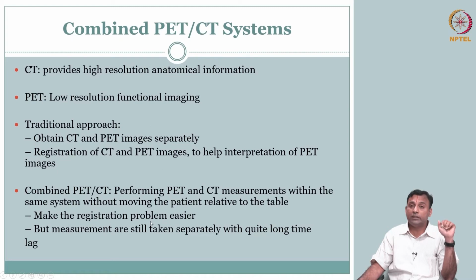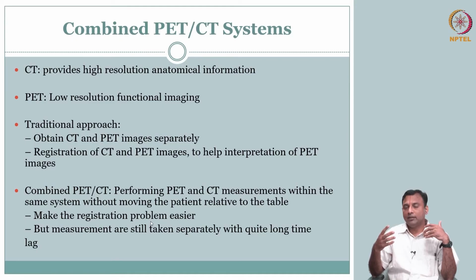This is very important, especially when you are going to do some study where you want to see how the heart is behaving. There the heart is moving, so you want to do it fast. So it is prudent that you have it in the same location.